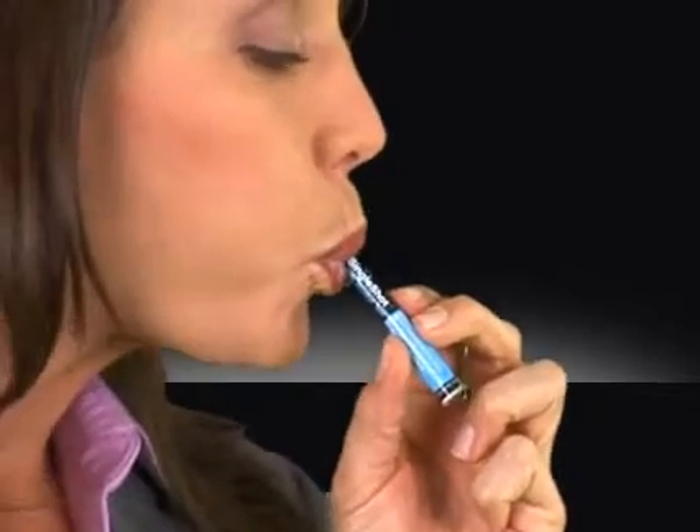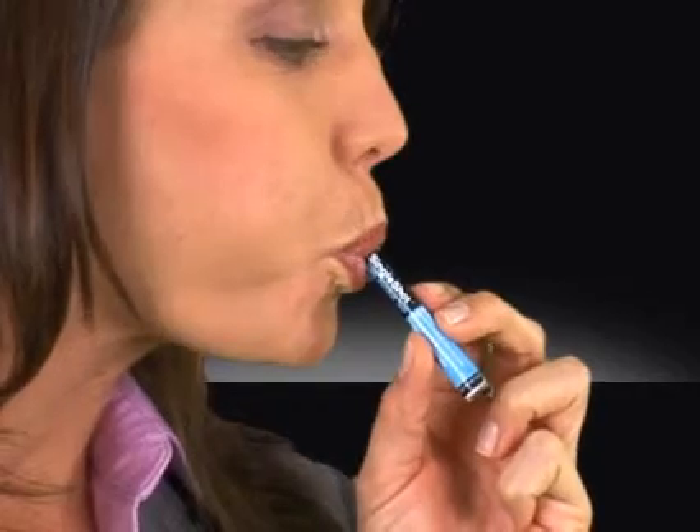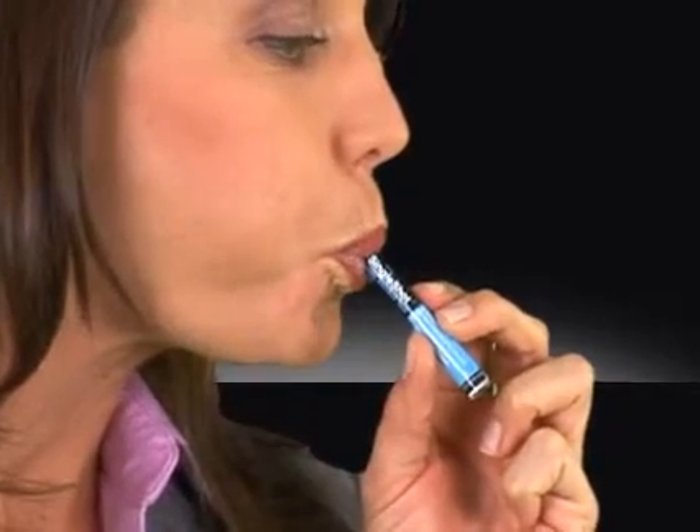Designed to be used just once, the Backtrack Single Shot is the smallest disposable alcohol tester available. To use it, simply squeeze the center of the tube, blow through it, and get quick results.